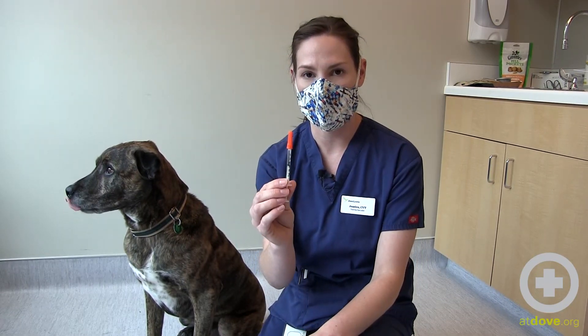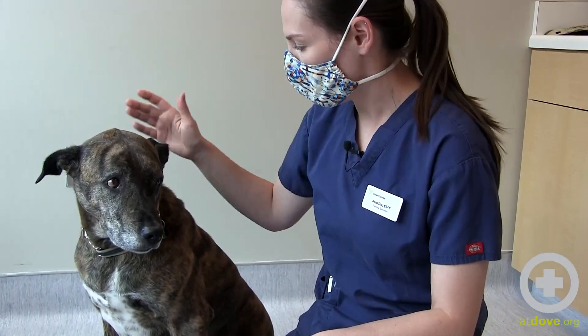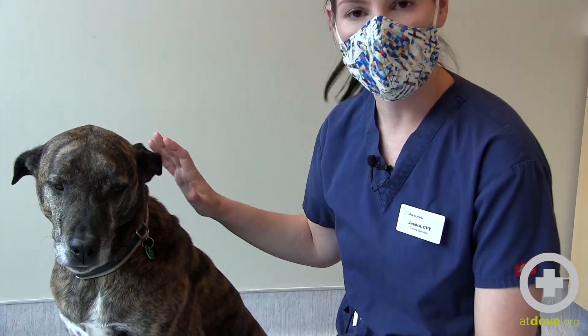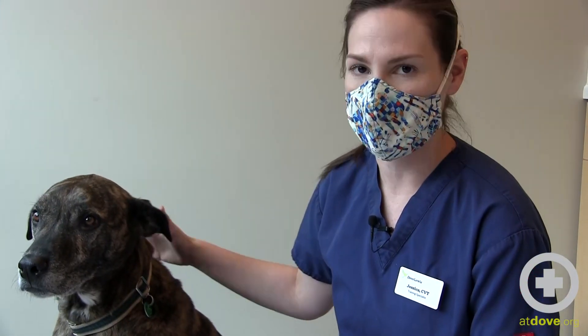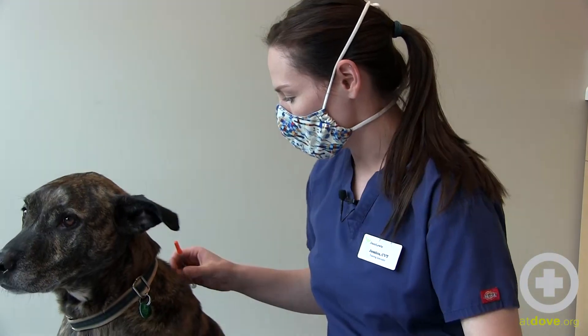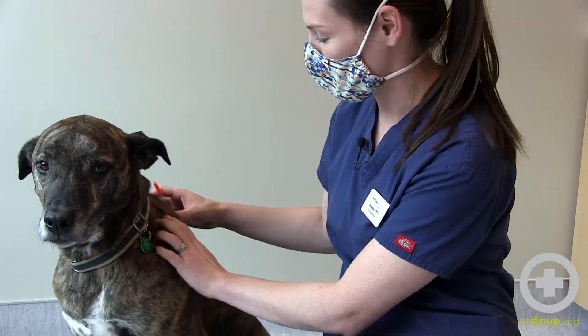We've drawn up 15 units of insulin. When giving an insulin injection, you'll want to move where you're giving the injection slightly each time, so you're not going in the same area and causing irritation. The subcutaneous space — he's got quite a bit — this is all subcutaneous area.